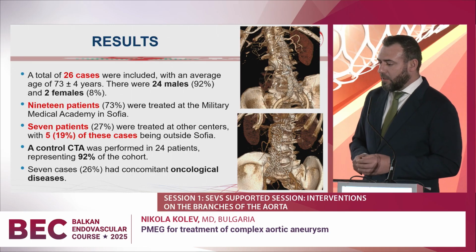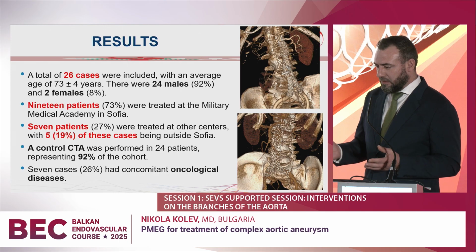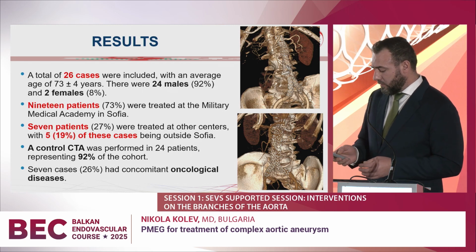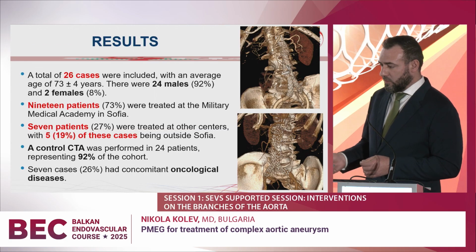Control CTA was performed in 24 patients. 2 of the patients didn't have the chance to have a control CT. We lost contact with them. They were from the deep province. And 7 of the cases were with concomitant oncological disease.